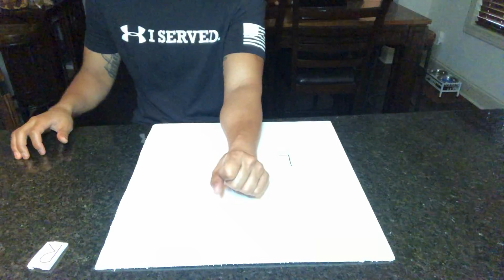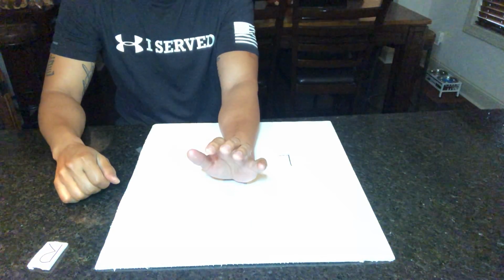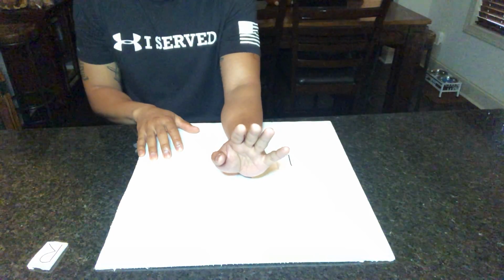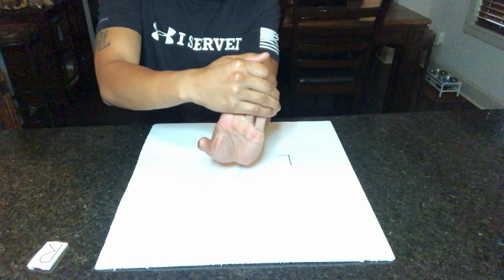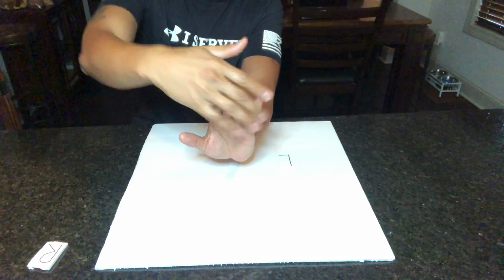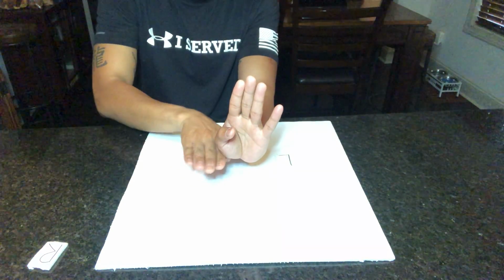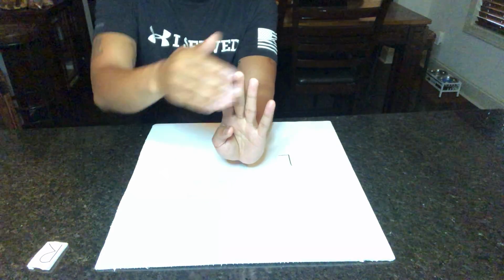Next is going to be the wrist carpal tunnel view. And in this particular projection, we're going to hyperextend the wrist back, either by having the patient use their other hand or some type of device that holds the fingers in this particular projection. Here we're also going to have a 20-degree support.